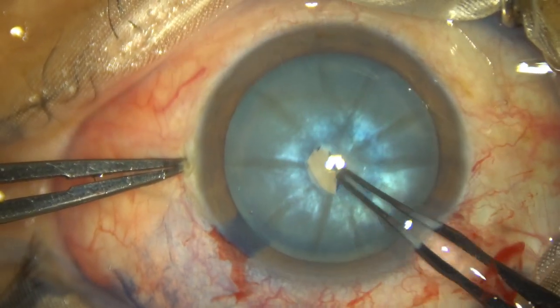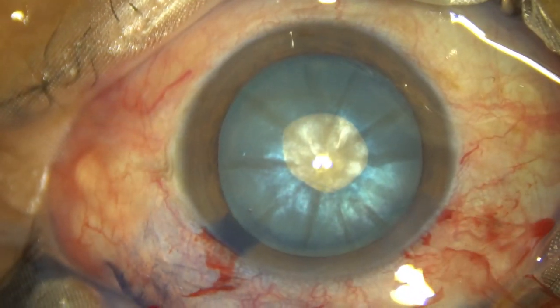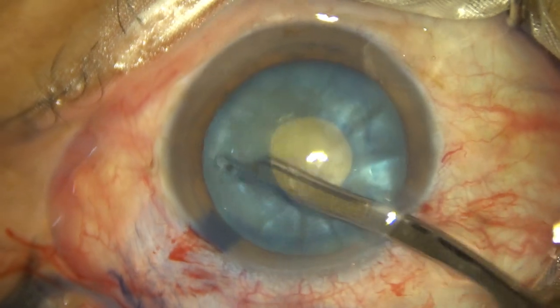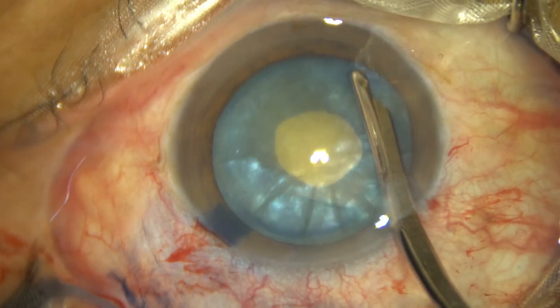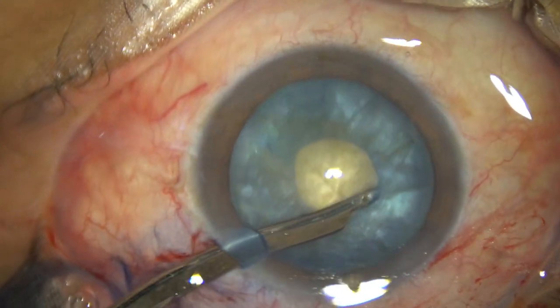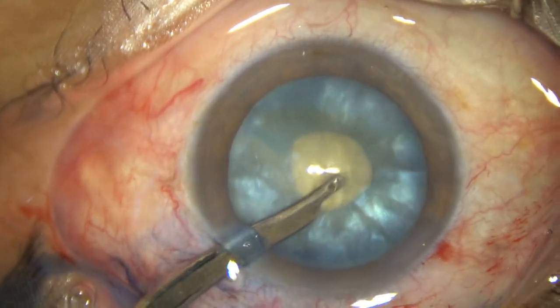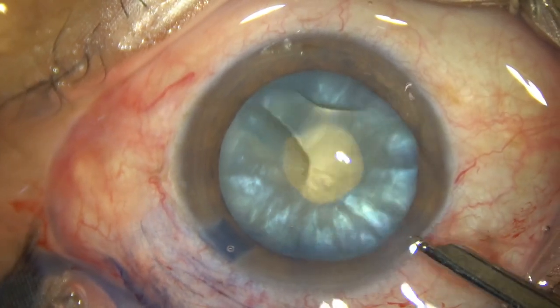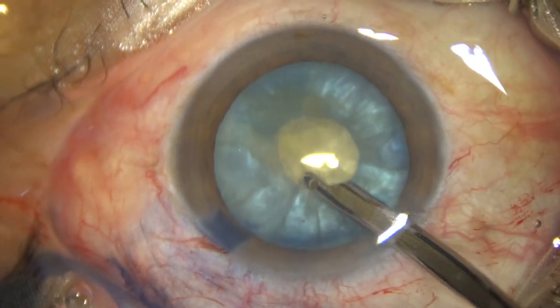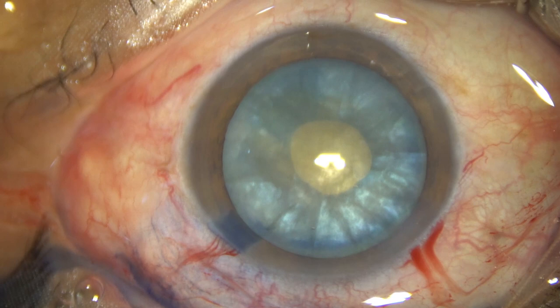The Utrata forceps makes a puncture and a C-flap is raised. This C-flap is converted into a small rhexis — a mini-rhexis. Some superficial cortical lens matter is aspirated by this 23-gauge Simcoe cannula. There should not be elevations anywhere, but in this case there were some elevations still in the upper part.